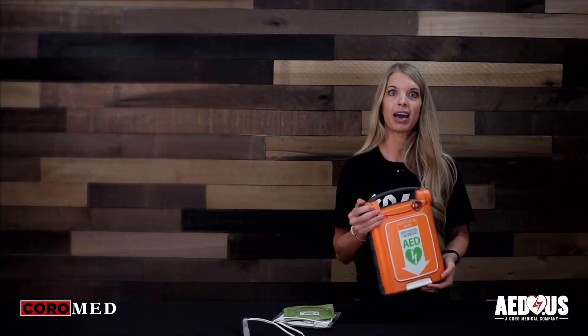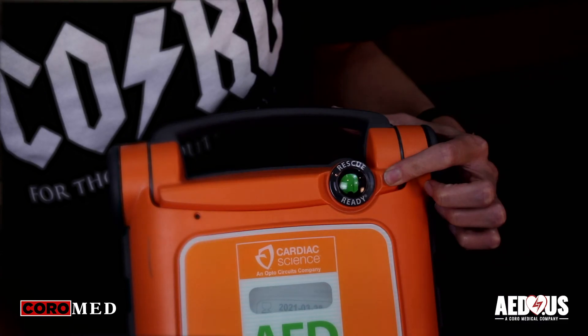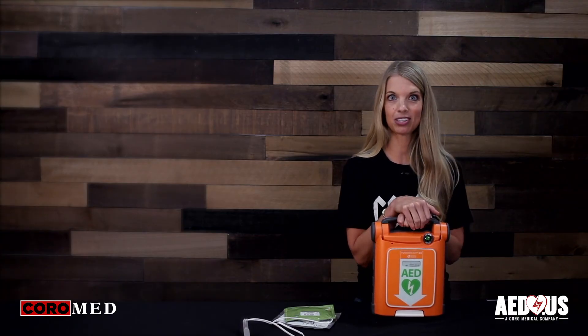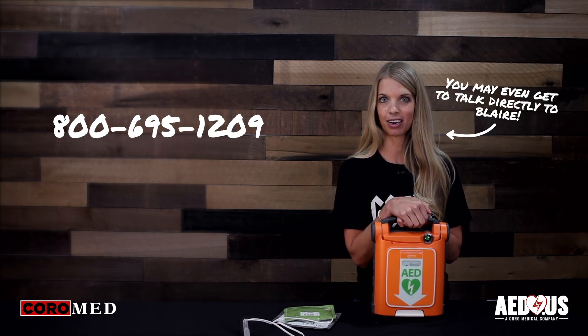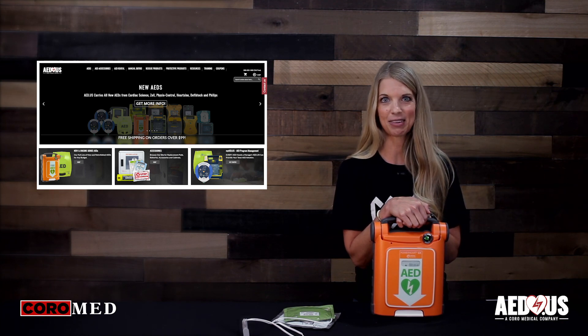Once you change the pads and batteries, you want to verify the rescue ready indicator is green and the AED is ready for rescue. If you have any questions or if you want to go over purchasing options, please feel free to give us a call at 800-695-1209 or go to our website at www.aed.us. Thanks.